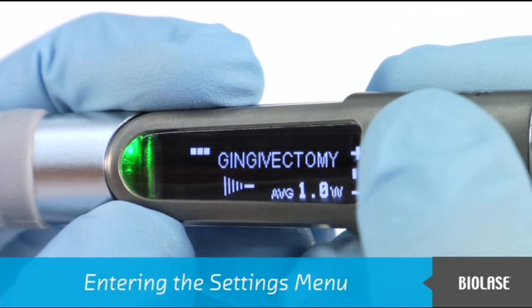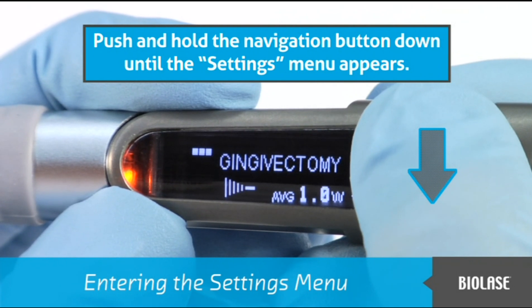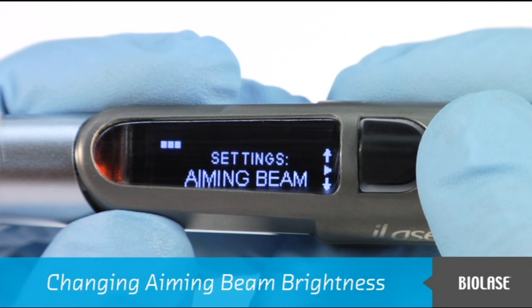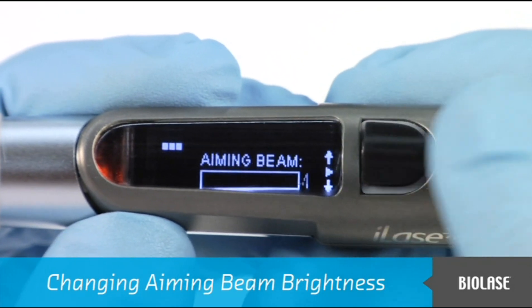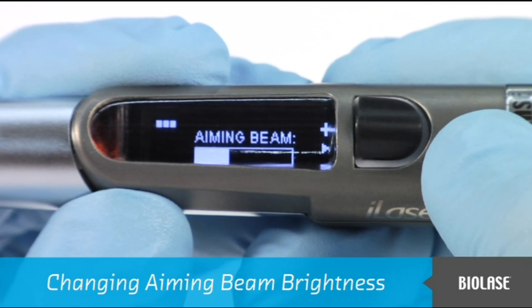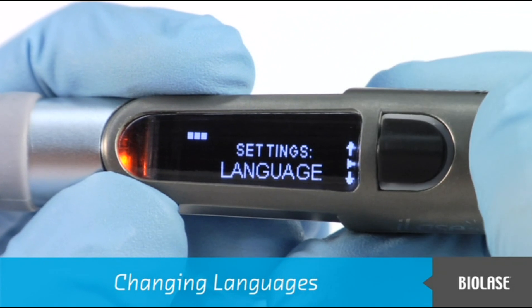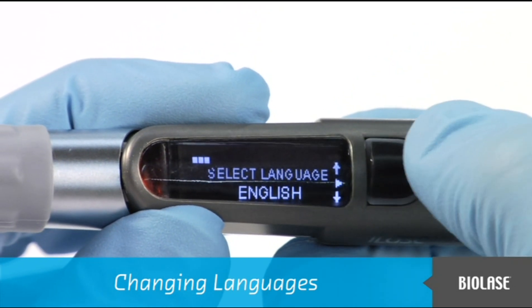To enter the settings menu, first place the iLaze into standby mode. Then from the main screen, push and hold the navigation button down until the settings menu appears. You may scroll through the different choices with the navigation button. To change aiming beam brightness, scroll to the aiming beam option and press in the navigation button. Pushing the navigation button down will dim the aiming beam, and pushing it up will brighten it. To select the appropriate brightness level, press in the navigation button. To change languages, scroll to the language option, press in the navigation button, scroll through the languages, and select your choice.